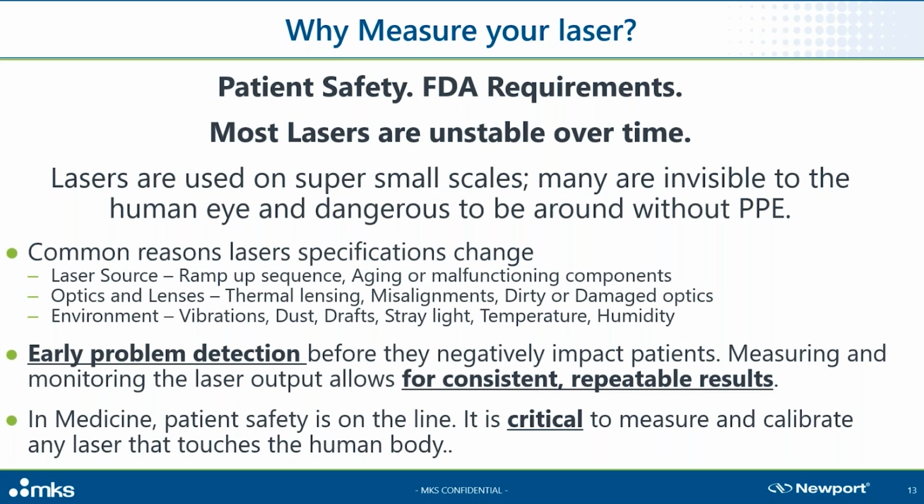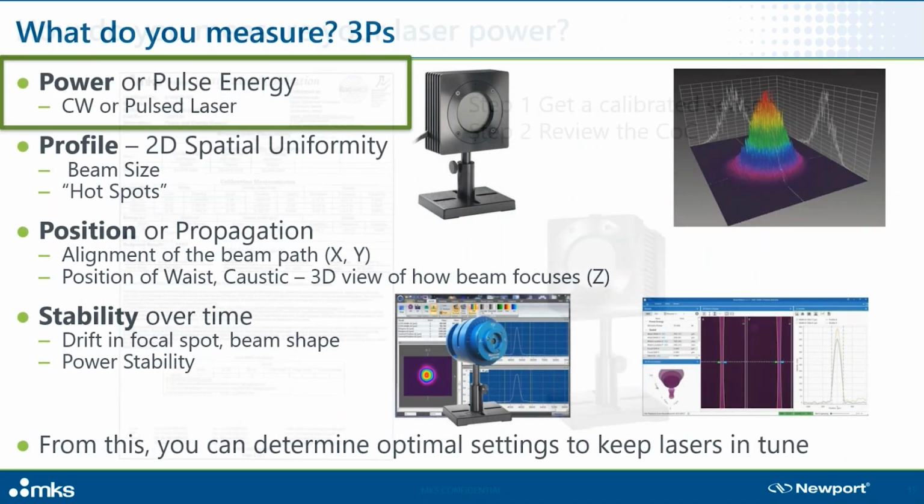Basically, lasers are great until they are not. And you want to know the minute a laser starts to degrade. Many lasers are invisible to the human eye, so you couldn't tell anything about the beam without proper tools. A small drop in power usually is an early warning sign before power and beam quality start to degrade. Once the process starts, it usually accelerates unless the user intervenes by servicing the laser.